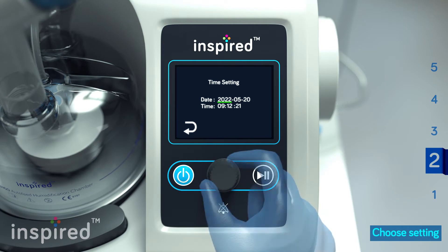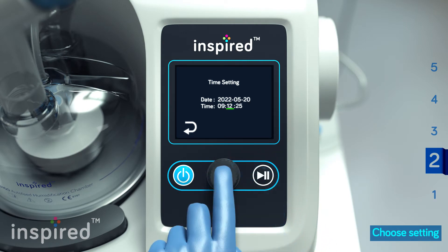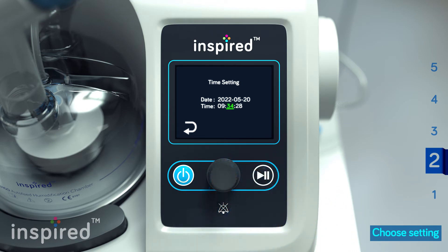At first startup, enter date and time information, then select save. Turn the knob to make adjustments and press the knob to confirm.